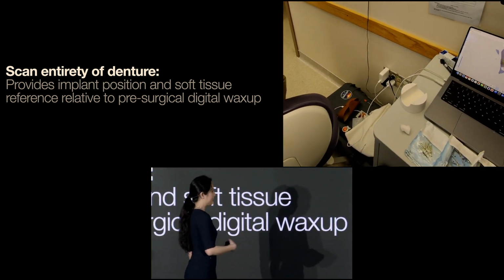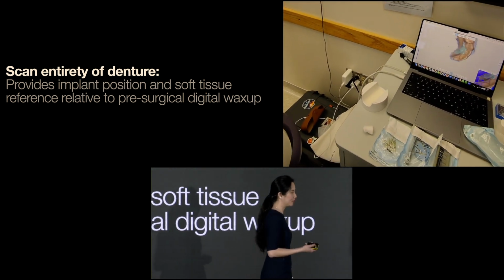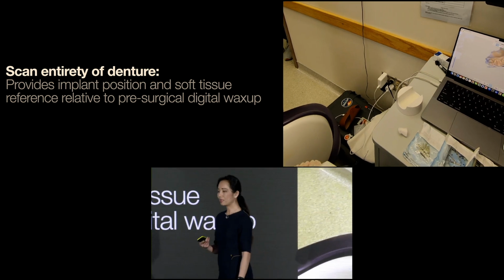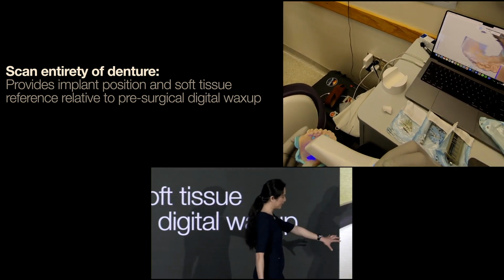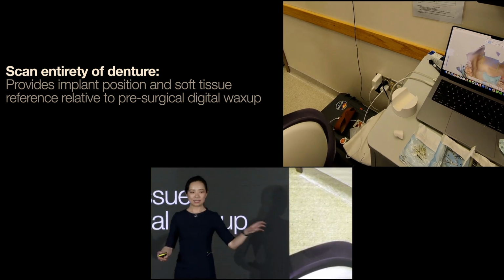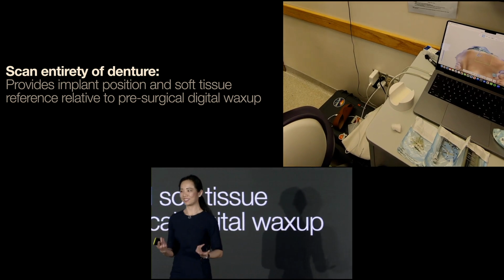From there, you scan the entirety of the denture so that they can merge it back into the original wax-up pattern, based on the original teeth setup or whatever markers are available at that point. In this case, I'm scanning in a monolithic denture to make sure that these teeth will actually merge back with the wax-up teeth in exocad.